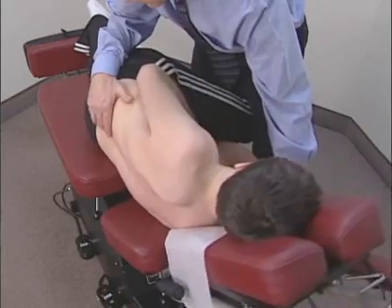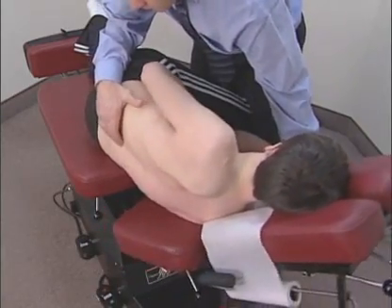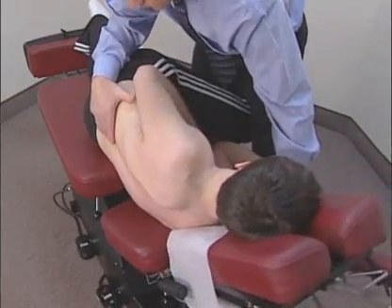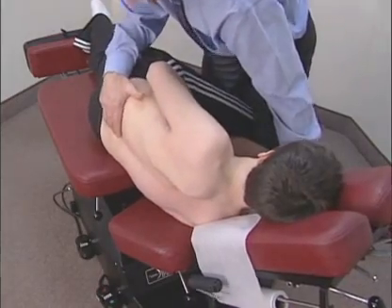To motion palpate the lumbar spine, push and pull the upper section back and forth. After you have located your specific spinal segment to be corrected, pull the tabletop towards you as far as possible to open the lumbar facets.